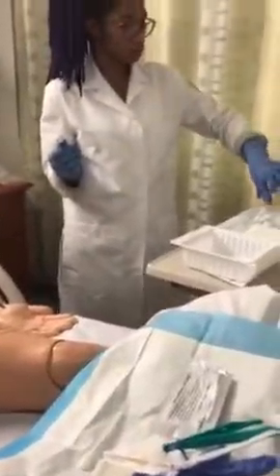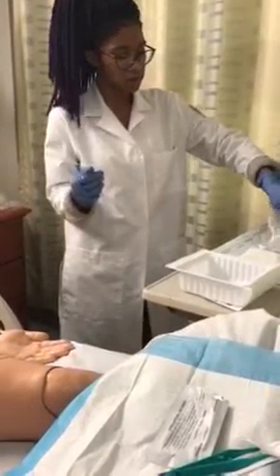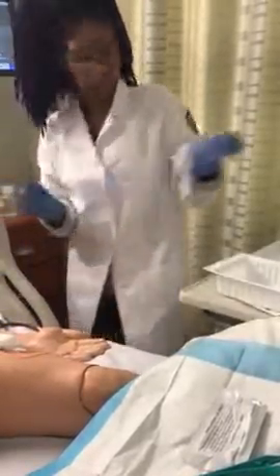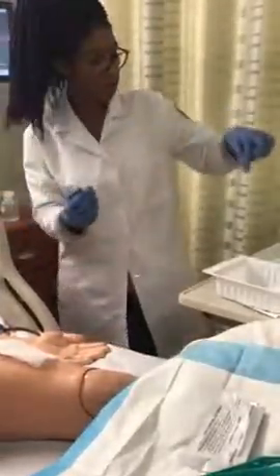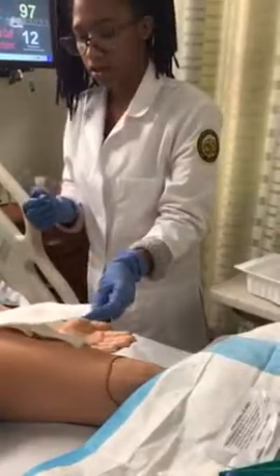And I am going to place my 2 4x4s on the wound. I'm doing so with my left hand, because my right hand is now clean. And then I'm able to place my ABD pad on top of this.